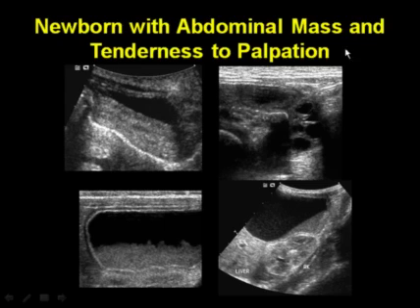Here's a newborn who presented with a large abdominal mass and tenderness to palpation. A transverse image of the pelvis shows a bladder almost empty. Here's a normal appearing left ovary. The normal right ovary could not be seen. This is a sagittal view of her uterus, which is quite prominent in the newborns due to more maternal hormonal stimulation. And here was a huge cystic lesion in the right adnexa that extended all the way up to the liver, as you can see on the sagittal view, and with a fluid level, just huge, extending from the pelvis all the way up to the liver.